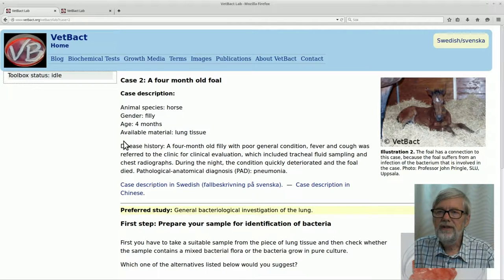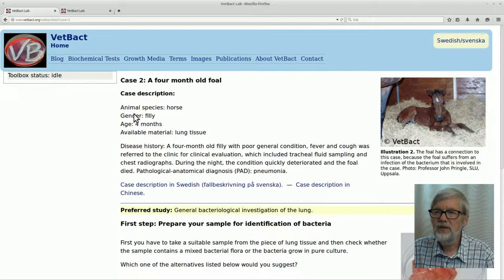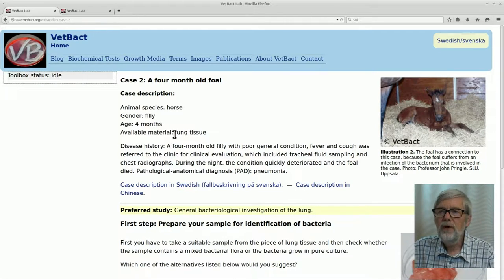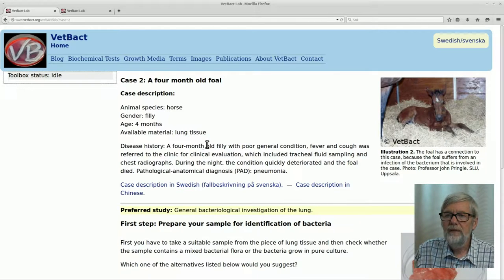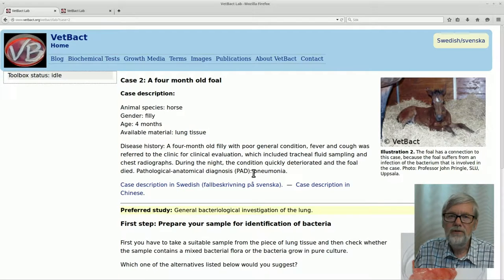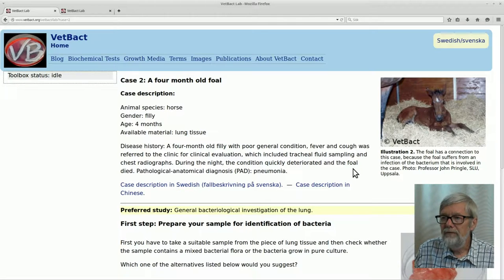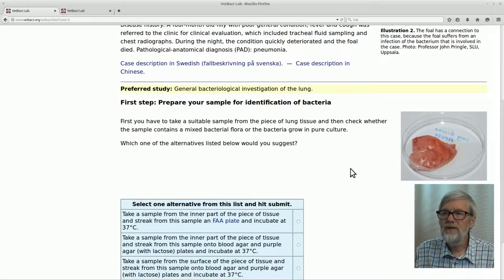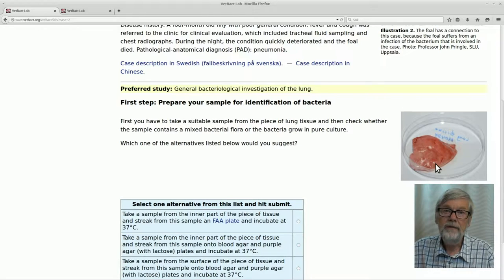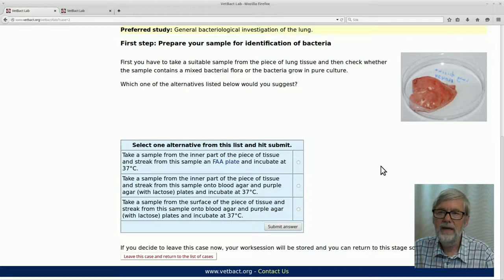Here we have a disease history and some information about the case. It is a horse, a filly. The age is 4 months and you have got lung tissue. If you read this you can see that the filly died, and the pathological anatomical diagnosis was pneumonia. Now it is your task to try to find out which bacterium caused this disease. If you scroll down here you will see what sample you get and some information about it.